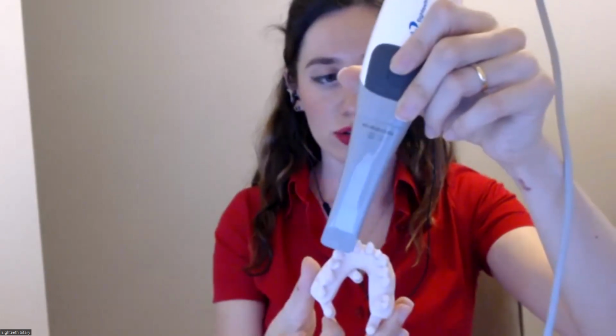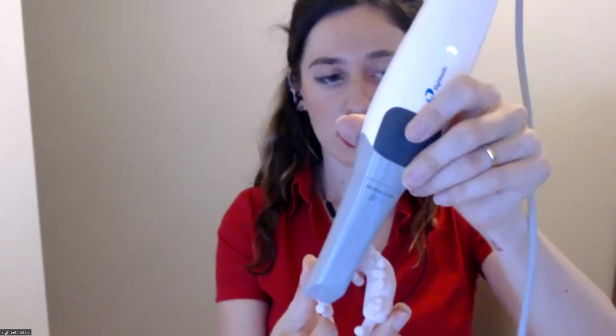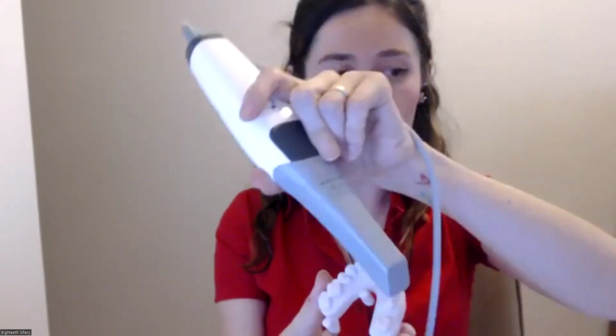First, we are going to scan the occlusal area and the palatal or lingual surfaces, which is complicated for a full arch, and the buccal sides. We are going to scan, and we are going to turn the sleeve and continue. Okay? This is very important. The scanning protocol is very important.